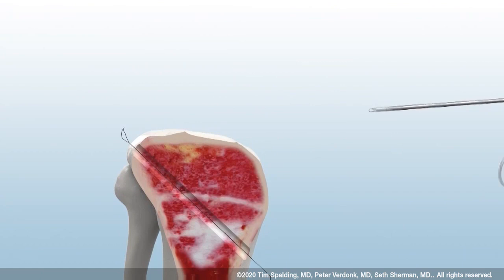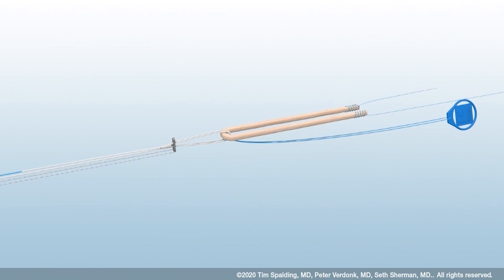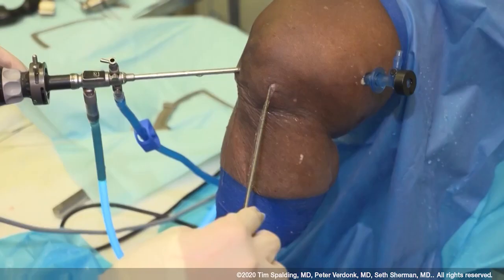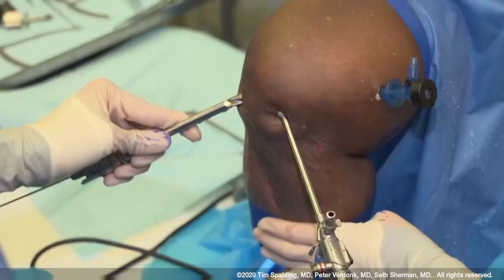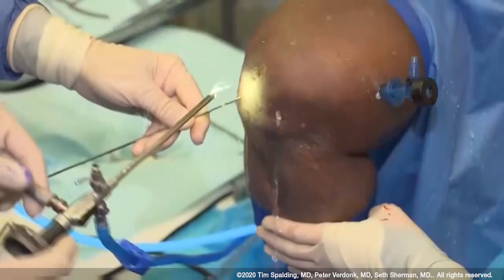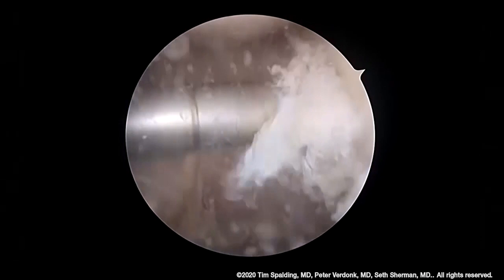The technique demonstrates a single-bundle hamstring PCL reconstruction using the infinity button, which is a reversible button. It can be shortened for introduction of the graft into the femoral tunnel, but if necessary it can also be lengthened and is reversible, allowing perfect graft positioning inside the tunnel. During arthroscopy, the first procedure is drilling the femoral tunnel. The tunnel position is identified and a useful trick is to introduce a reamer with the guide pin already inside. You can identify the sweet spot, then introduce the guide pin into the femur. Once the guide pin is in, over-drill with a reamer up to 20 to 25 millimeters, followed by introducing a loop on the femoral side.